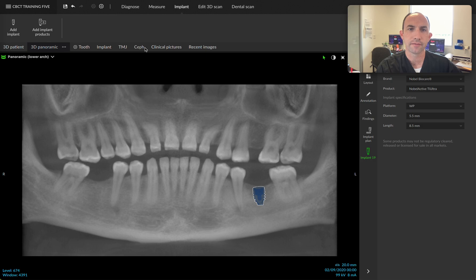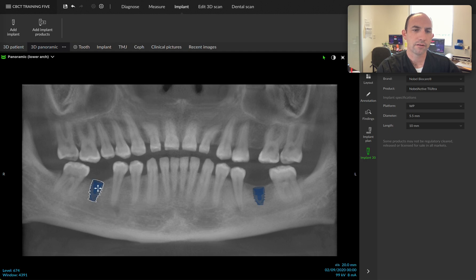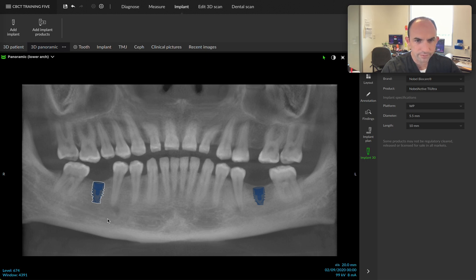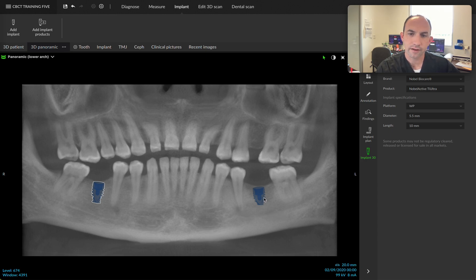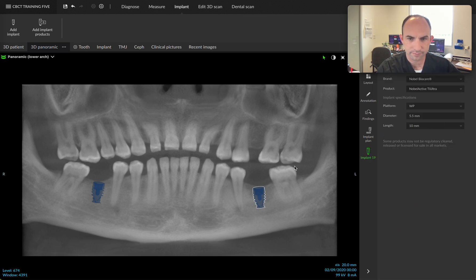If I want to add another implant, I'm going to click Add Implant again and indicate the shoulder point and the tip point. Pretty simple. It defaulted to the wide platform. I'm going to roll this over just a little bit to get a better delivery pathway, assuming I'm going to be restoring it — we want clear access to that opening. It looks like we've got plenty of space above the inferior alveolar canal. So I'm going to click on implant 19 and make that a 10mm implant. Still a couple millimeters of space there.